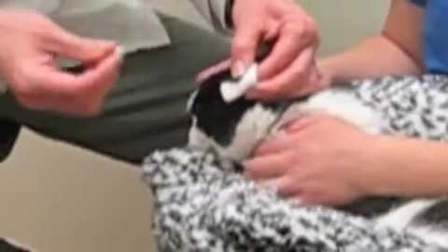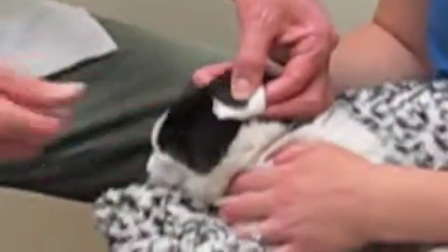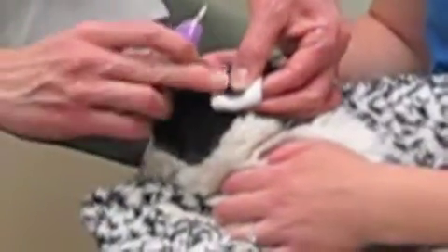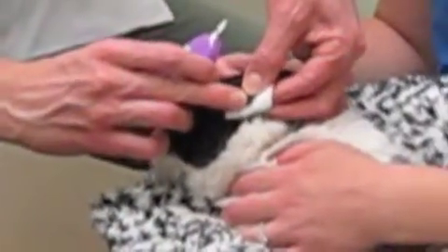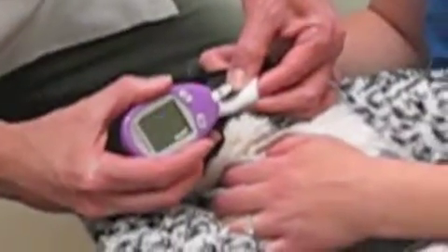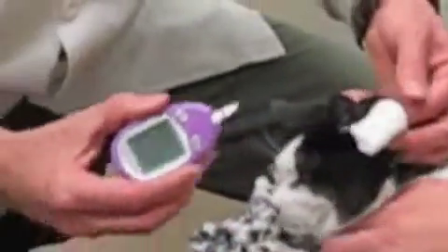Leave it in there for a second, take it out, and again just apply a little pressure. You'll see a nice bead of blood forming. It's the edge of the strip that'll take that sample — so that should be plenty. I'm just going to come in right to the black dot at the edge. Then you can use that same gauze to hold it.